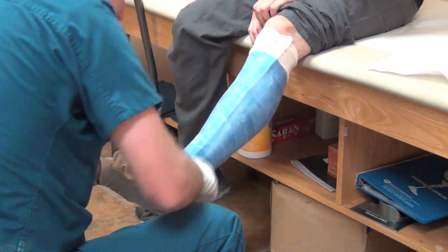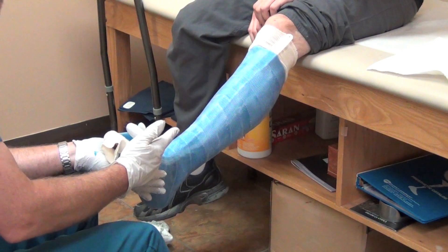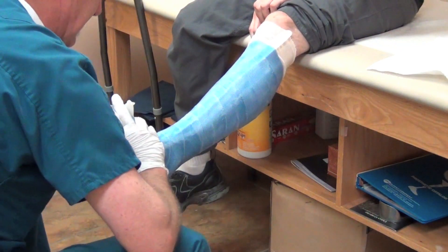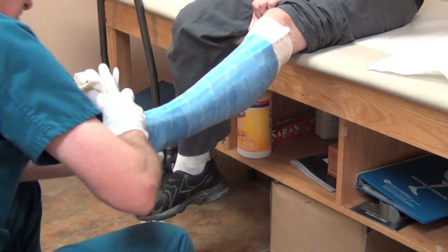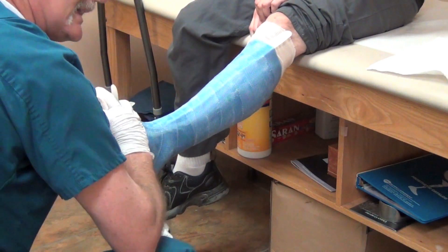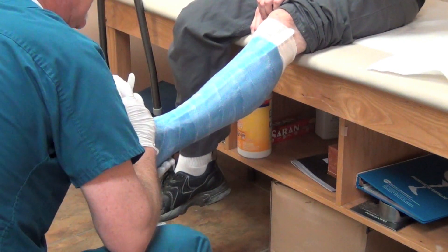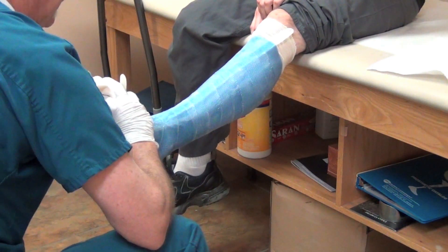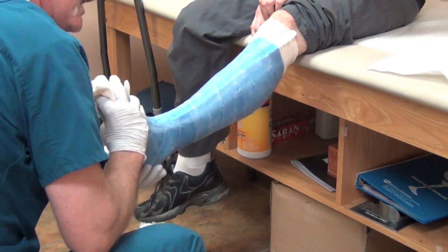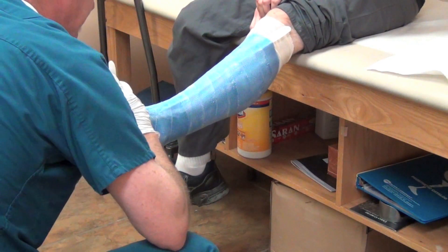Highlight your cutting strip. Then what I do is take my middle finger and put it under the cutting strip, my forefinger in the sulcus of the toes, and my thumb in the metatarsal region where you would put a metatarsal pad. What that does — and I grab the foot — that allows me to manipulate this foot any way I want so I can get my forefoot balanced with my rear foot.